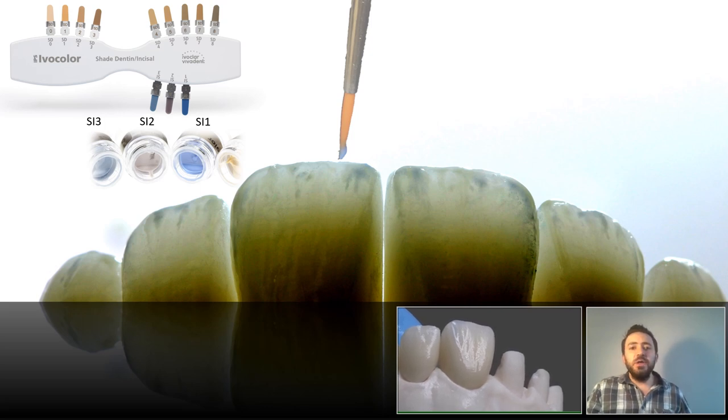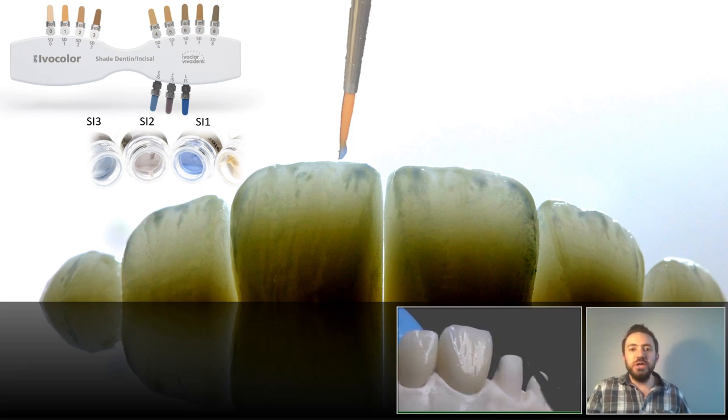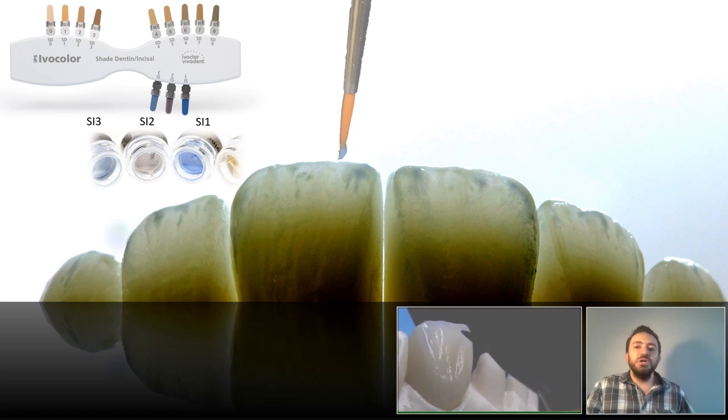Then with Incisal 1, using the tip of my staining brush, I leave an interrupted small line — could be horizontal, like this shape — right below the incisal edge. Then I bake these three shades at a low temperature, around 700°C, just to have them fixed in place.